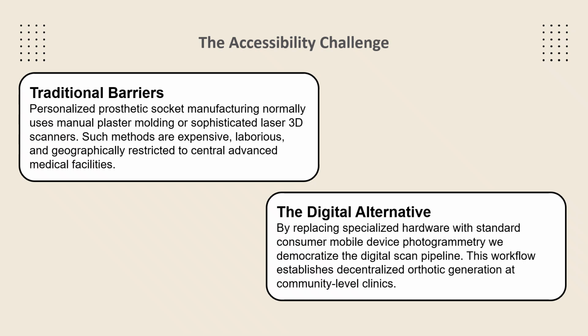This leaves amputees in remote or resource-constrained settings with little recourse to modern orthotic devices. This work presents a digital replacement for those old barriers.